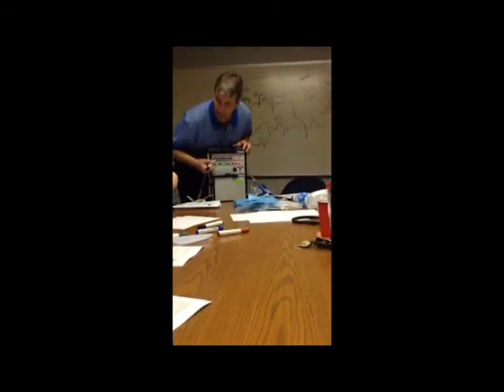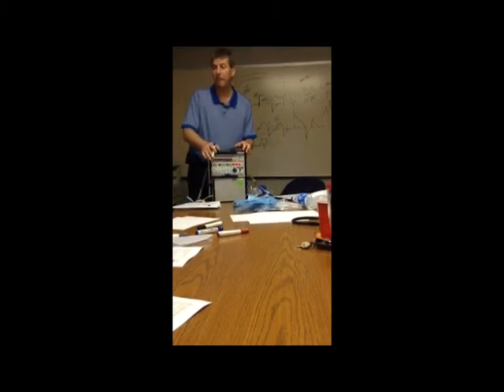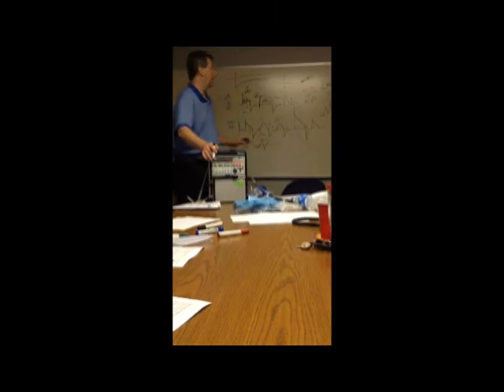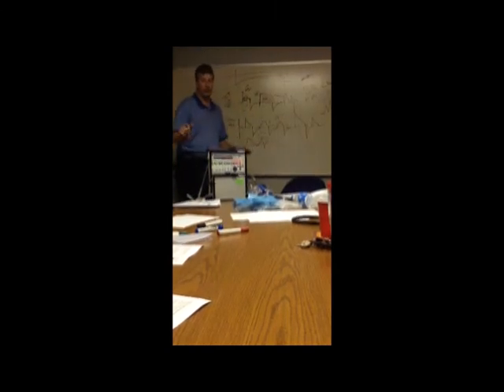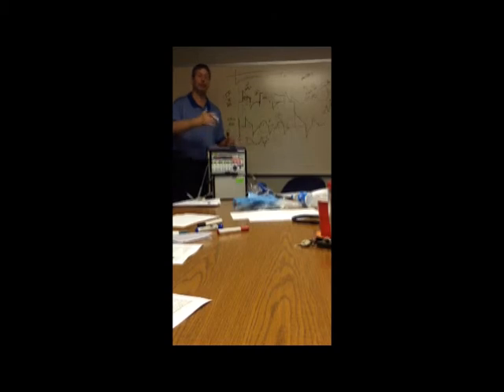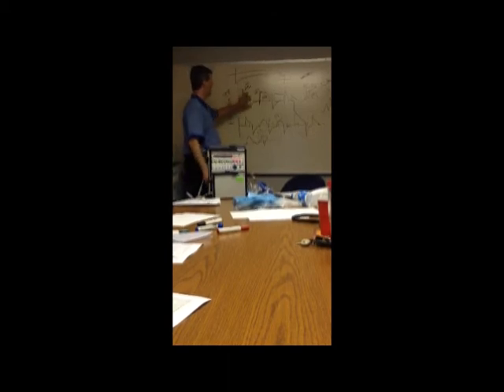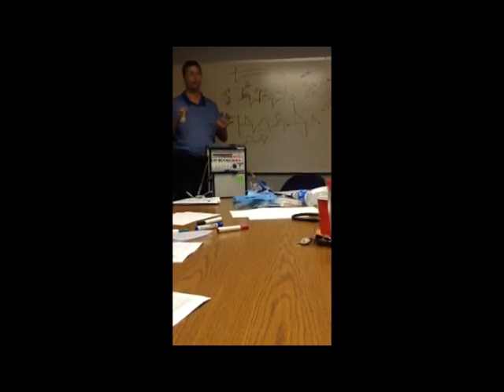PIP, yeah. You'll see it listed here, but you'll also see it where that last beat stays is the PIP as well. How can it be adjusted with the buttons? Like if you needed to adjust from 20 to 35 because of the CHF or whatever, because the volume is 400 and not 500, how would you adjust the pressure on here? That's in volume ventilation, okay? So you don't adjust the pressure, you adjust things that yield in the pressure being higher.